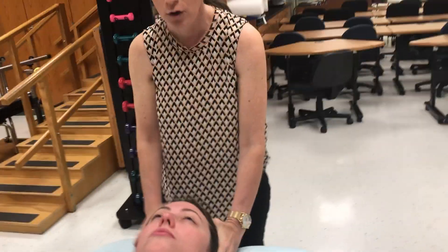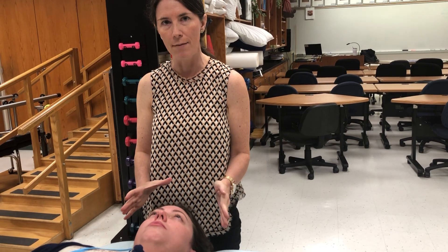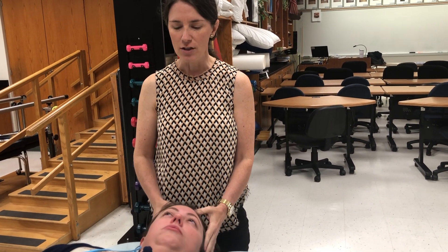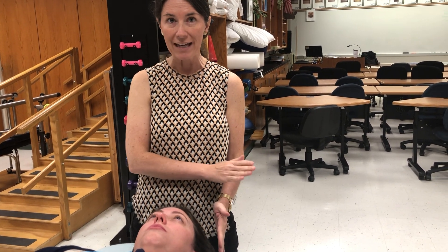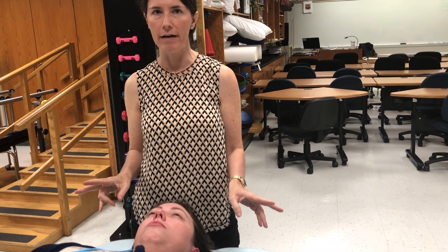Sometimes you're going to have someone who, instead of staying still and resisting you trying to turn them, they're going to try to turn their head into your hand. So you would just say: hold on, don't try to push me away, just try to stay still and don't let me push you. Those are two very different things.